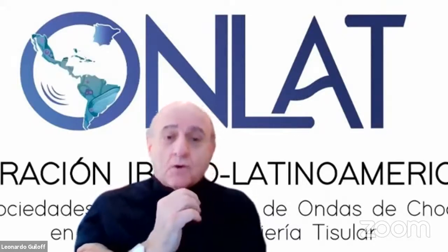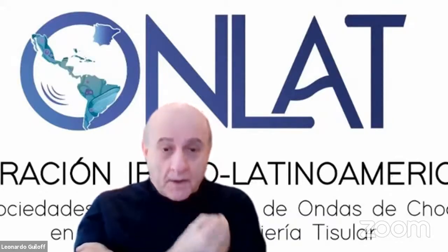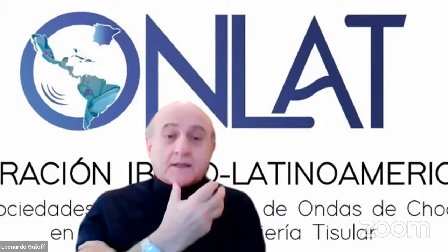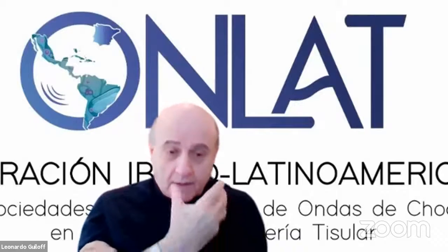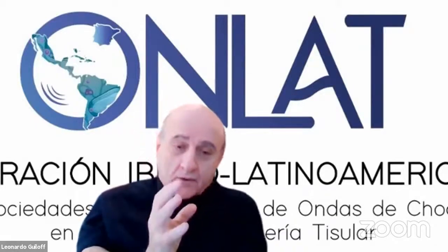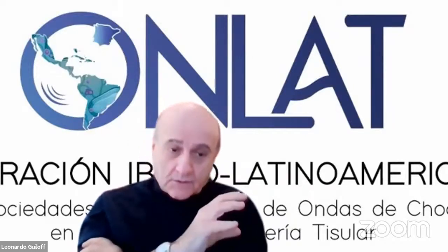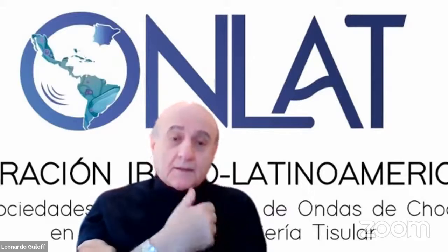Another important thing is to know how to use the devices and what device you have. And you have to take courses, practice courses, not only online courses, to know how to do it. This is a presence technology. You have to be with the patients to know how they are, the reactions. The other important thing is that these technologies are of two types, pressure or radial shock waves, and focused. There are different technologies, but we can apply them in the different pathologies.